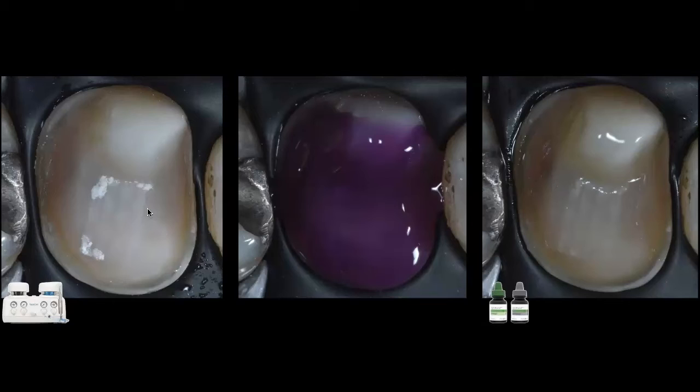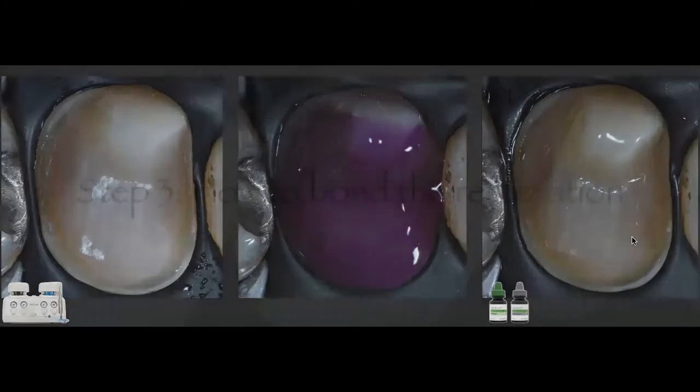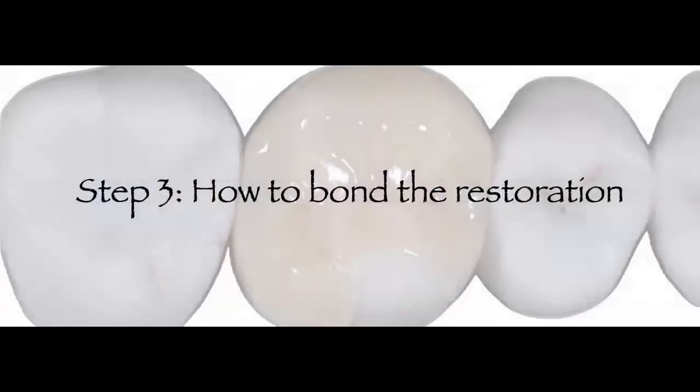And now I'm going to apply 2 coats of the primer and the adhesive of OptiBond eXTRa Universal on top of the enamel and on top of either my resin coated layer or my core buildup, as you are seeing in that photo on the right-hand side. Right here, I do not light cure. I leave my adhesive there. I like the 2-step primer and adhesive, and then I go to my step 3. Keep in mind, I have not light cured my adhesive yet. Obviously, I'm breaking this down for teaching purposes, but in clinical reality, you do this one step following the other. The following step is, how do I bond my restoration?